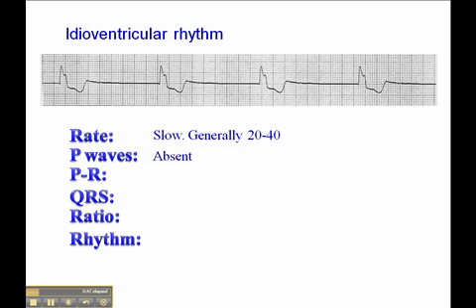P waves are absent in an idioventricular rhythm and consequently the PR interval is not applicable. The QRS is wide, always wide, so at least 0.12 second and typically closer to 0.14, 0.16 second.